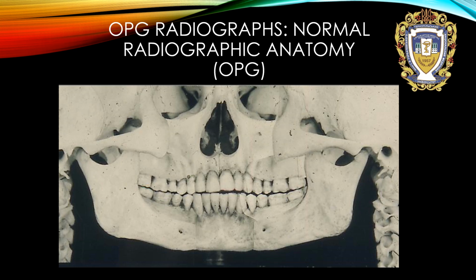They show what we will see on panoramic X-ray. It is our skull, a volume object, a 3D object in 2D imaging.